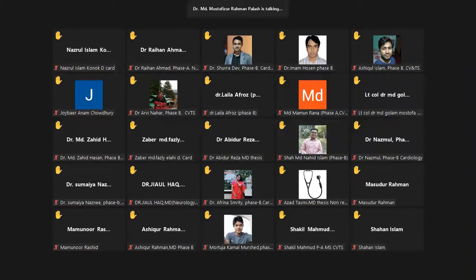And there, this type of management, and the 2017 ACC guideline was not like that. You have to mention it at first, not the vagal maneuver. You just go for whether it is hemodynamically stable or unstable. Then, if it is unstable, go for the shock. If it is stable, then you look for the other conditions.